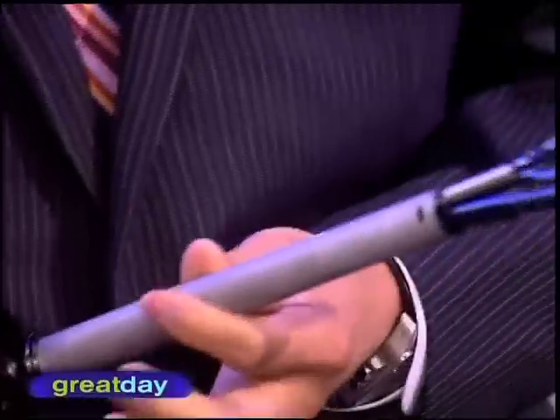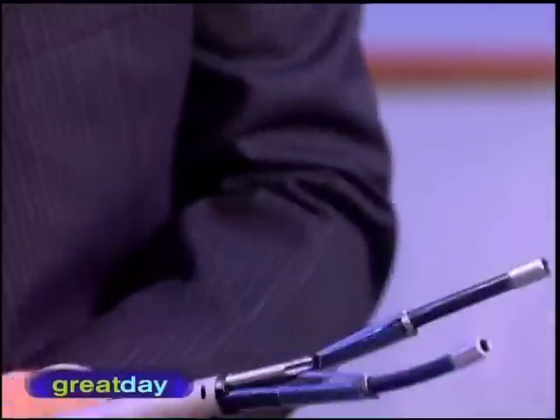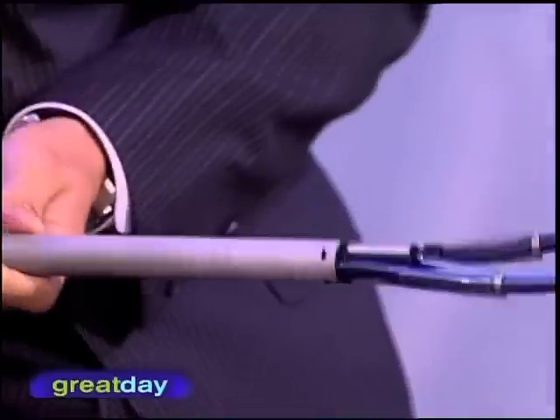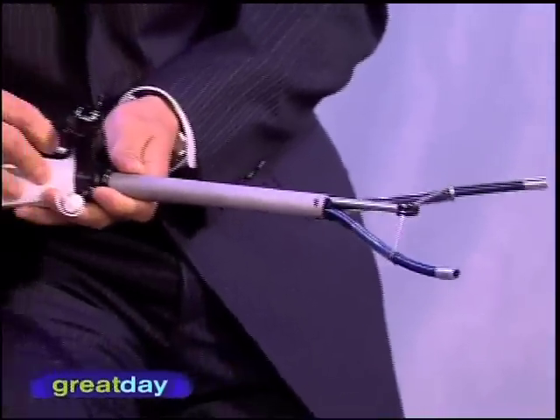How many times have you said as a surgeon, "if I only had more arms"? Exactly, always. And so this is more arms. This great device allows you to introduce something through one incision about the size of a dime — about a centimeter and a half — but once we get in, the key is it goes in as one piece and then opens up and deploys like an umbrella.